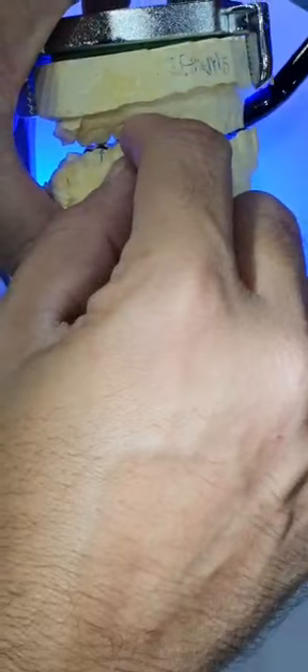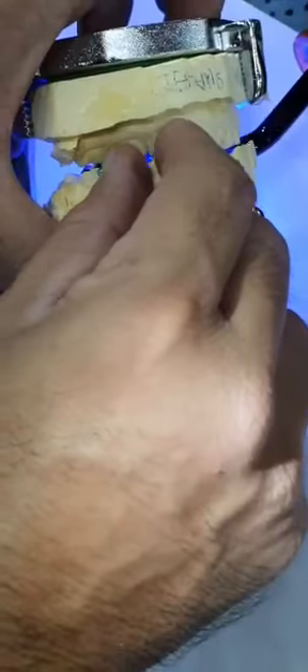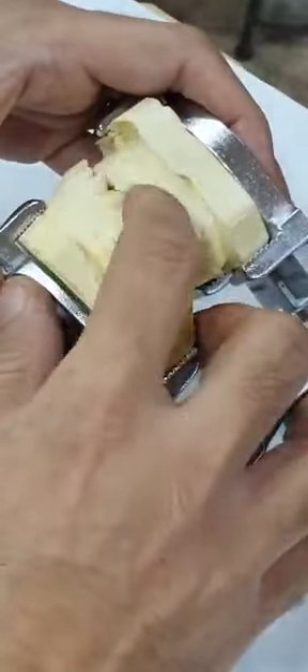The right side is already stable. On the left side, go ahead and prep the upper and lower teeth while they're open. As soon as preparation is done, take the impression with the open bite on the left side while fully occluded on the right side. Take the prefab temporaries made by the lab in the open bite from the impression taken the day before, and cement those temporaries. The patient now has fully balanced temporaries. Get the crowns manufactured, try them out, and cement the left side crowns.